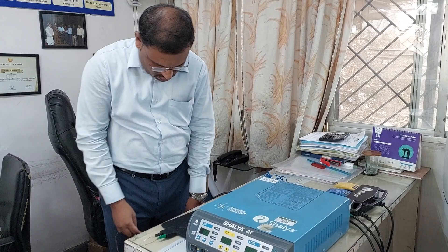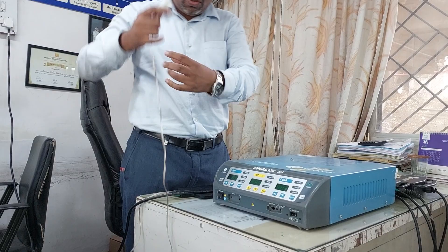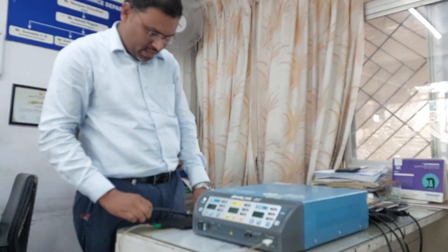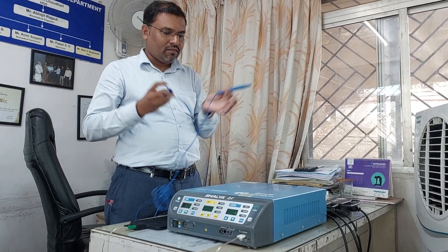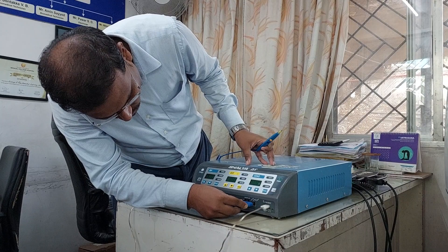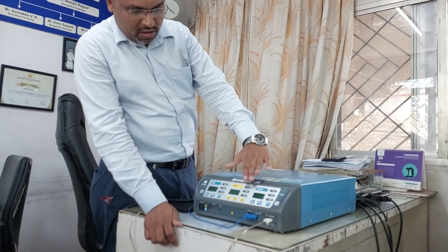This is a silicone patient plate. You can observe the different sockets on the machine — this is the bipolar socket, this is the monopolar socket, and this is the patient plate socket. Here I am connecting the patient plate, and after that I am going to connect the monopolar electrode.